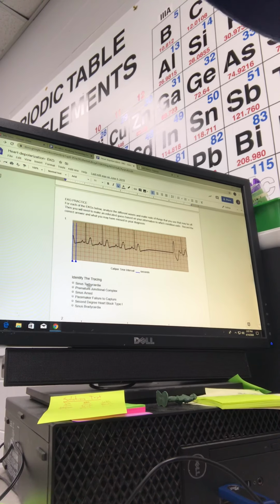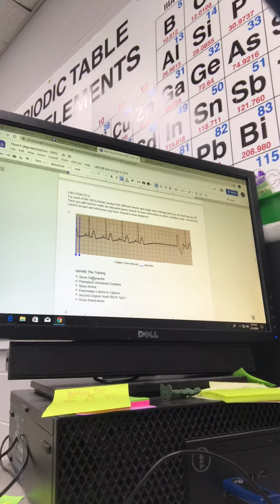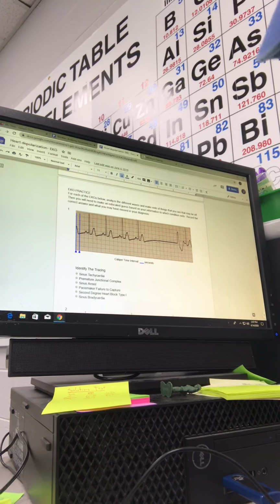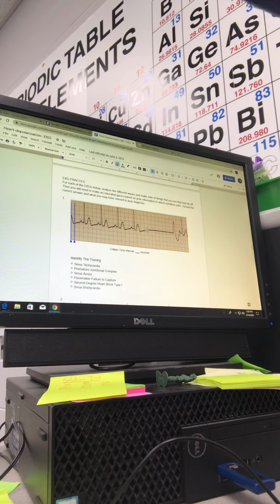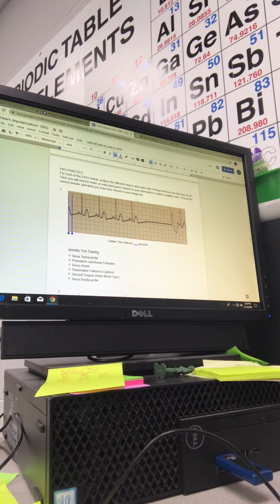I'll tell you right now, I know tachycardia means you have an accelerated heart rate. Your heart's beating at an irregularly fast pace. Okay, you see that, do-do, do-do, do-do, do-do. Oh, shoot, something happened right here. Uh-oh, that can't be good. All right, so anyway, you're probably wondering, how do I find out what this stuff is?